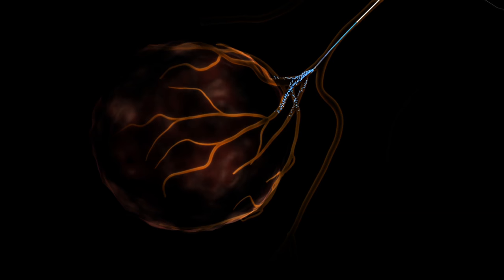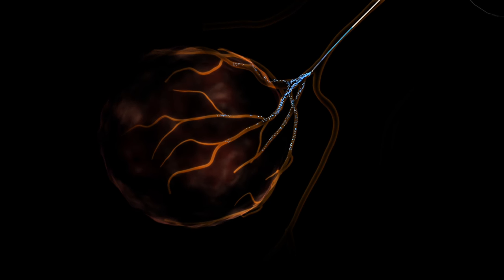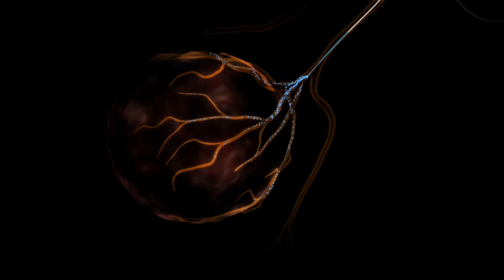Once the target site is reached, infuse diagnostic, embolic or therapeutic materials such as embosphere or quadrisphere microspheres.